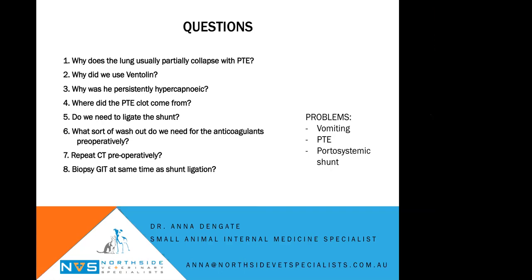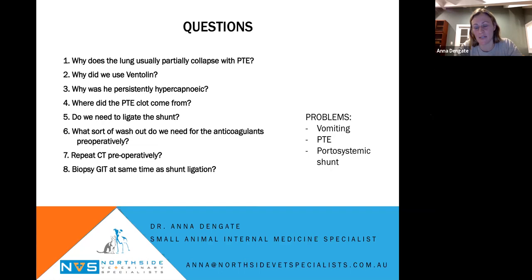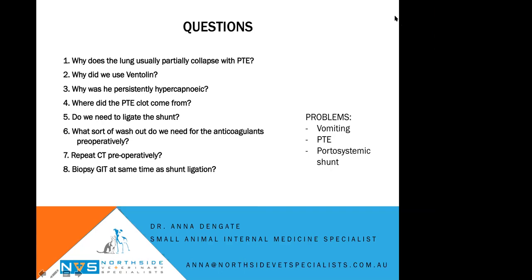I think I'd entertain the idea that they were unrelated if this was a first occurrence, but this has happened to this cat twice. So it's had an acute onset respiratory distress associated with vomiting. And the distribution of changes, I mean, this wasn't aspiration pneumonia this time. The cat had normal laryngeal function, which I looked at in detail on induction for the CT. I struggle to think that a cat would have aspirated. I feel like this has happened twice in this cat.